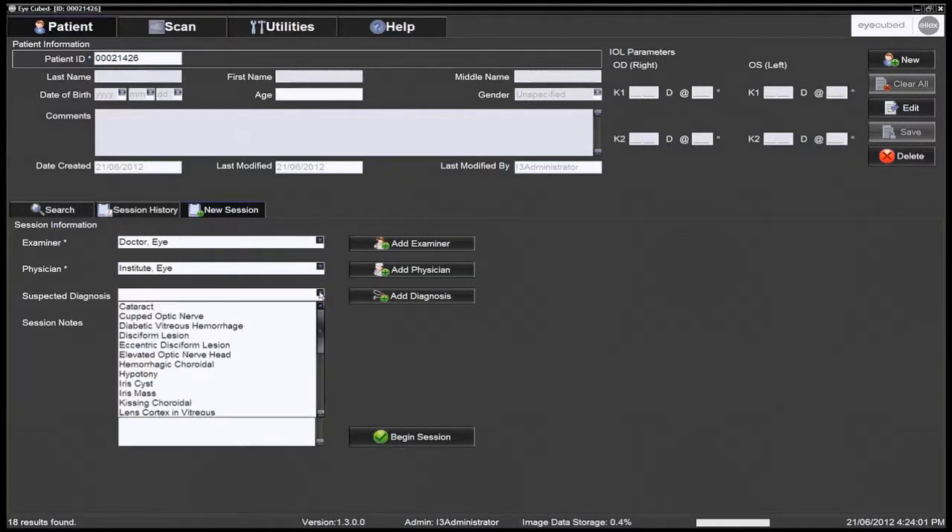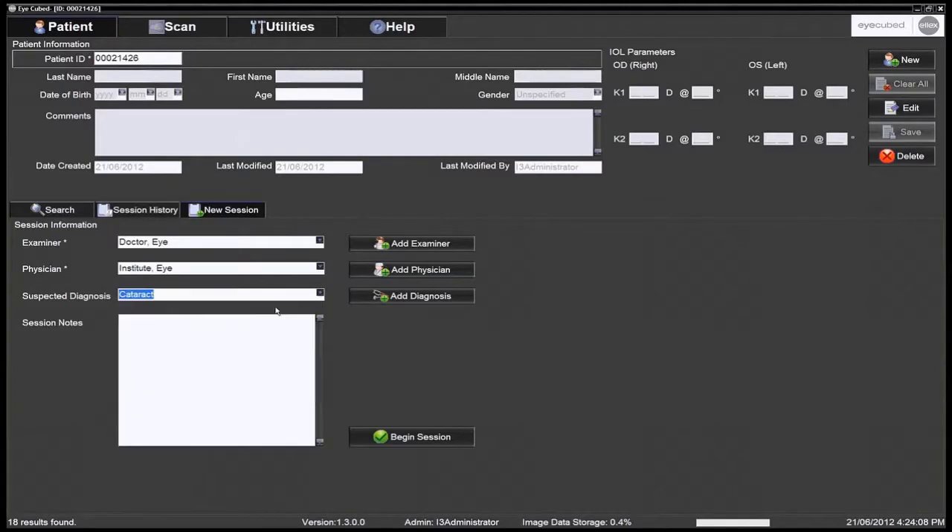At this point, it is possible to add a suspected diagnosis that will be saved in the patient's file. Click Begin Session to start the examination.